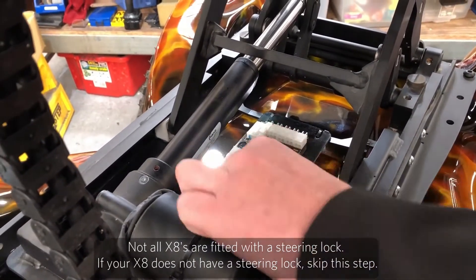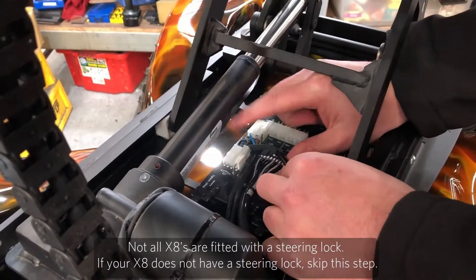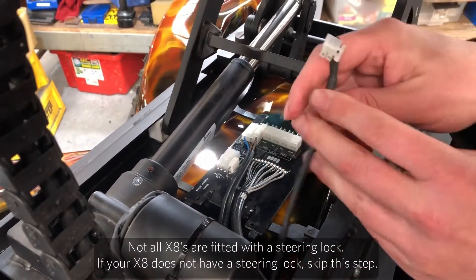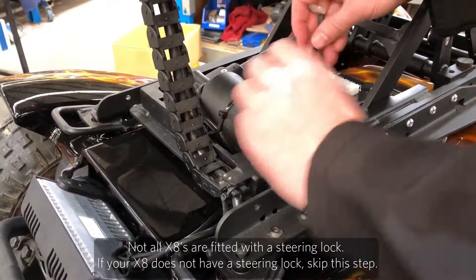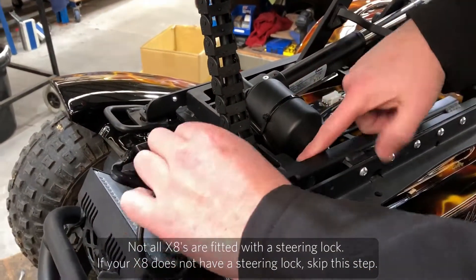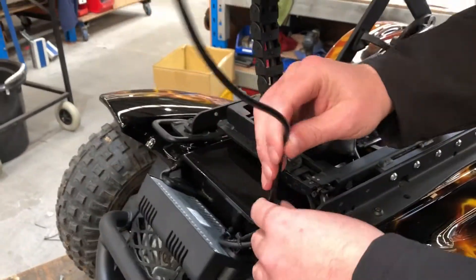We then follow the steering lock wire to the circuit board and, using the clip on the top, press it down and remove the plug. We then drag the wires out from under the seat unit towards the power module at the rear so it's free and can come off.